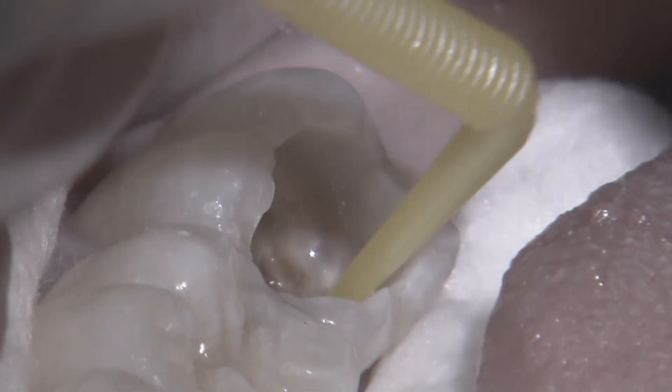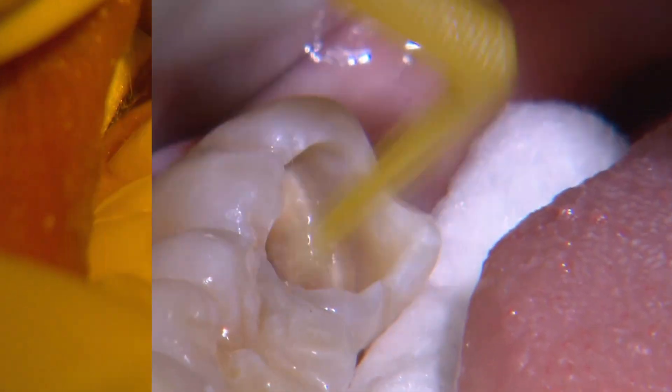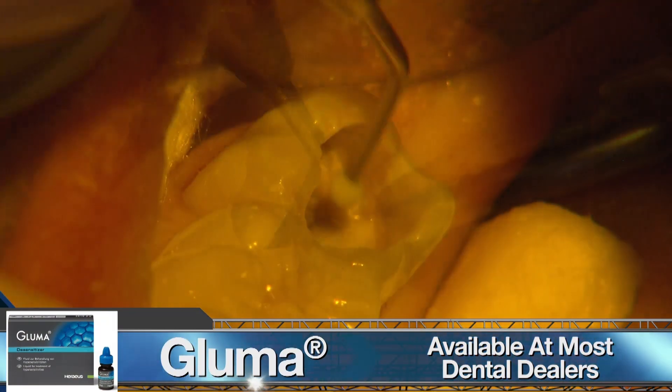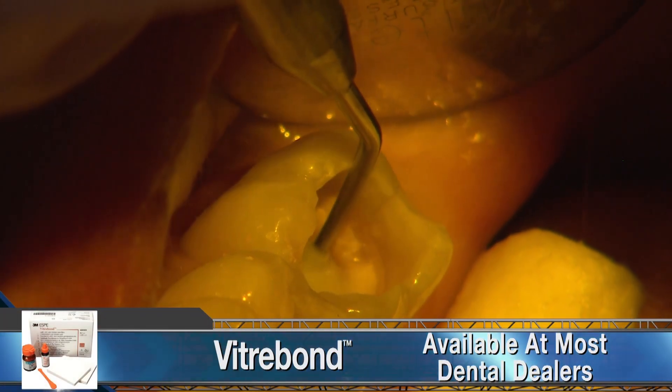At this depth, I condition the cavity with polyacrylic acid for 20 seconds and then apply Gluma for a minute. We then complete the indirect pulp cap with a thin layer of Vitro Bond along the pulpal floor.